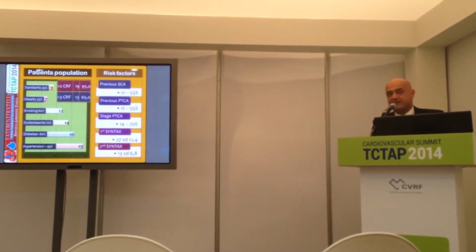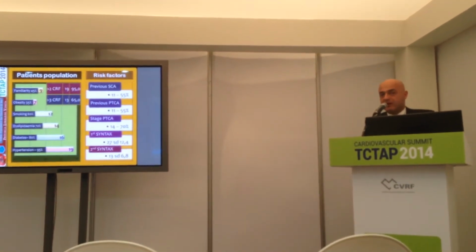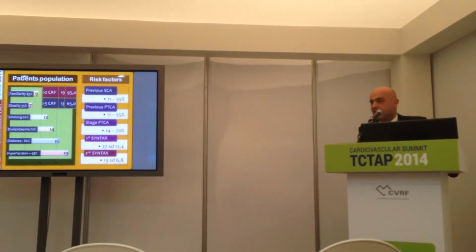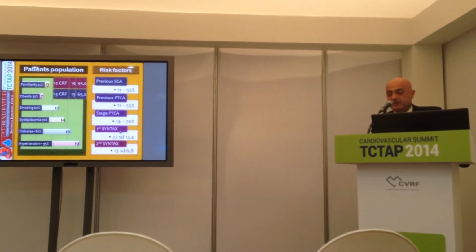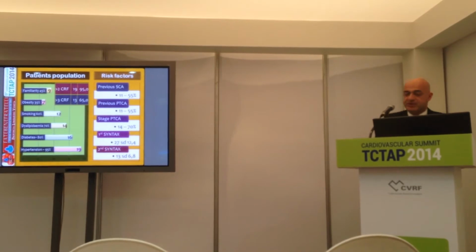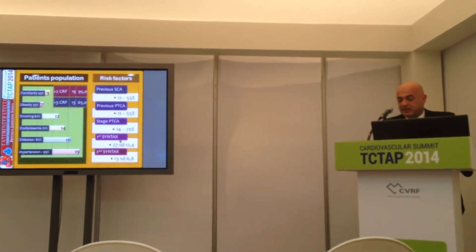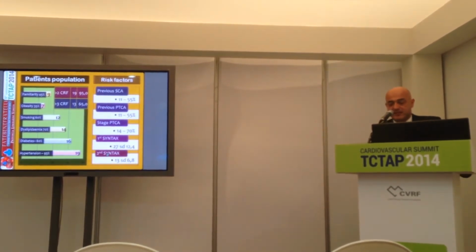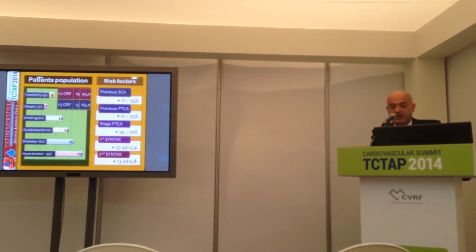Now we are placing Axxess ad hoc, during the procedure, but at that time we were getting experience, so we selected patients for Axxess very carefully, not saying that we're not thinking now. Something interesting was the SYNTAX score in patients who had a second, staged procedure. At the first presentation they had a SYNTAX score of about 27, and when they came to have the Axxess stent placed, their SYNTAX score was 13.